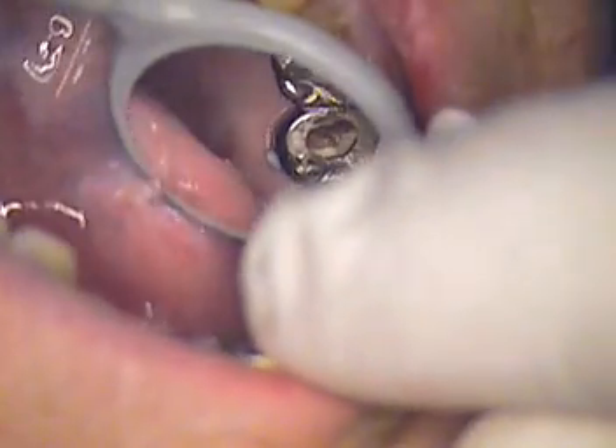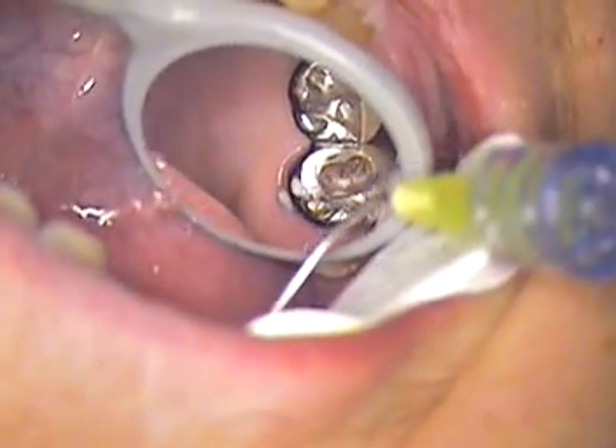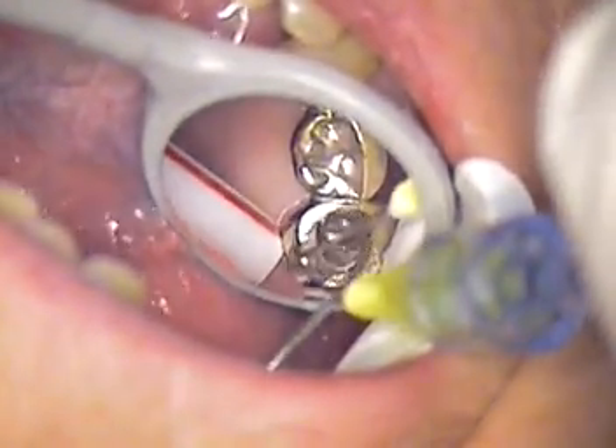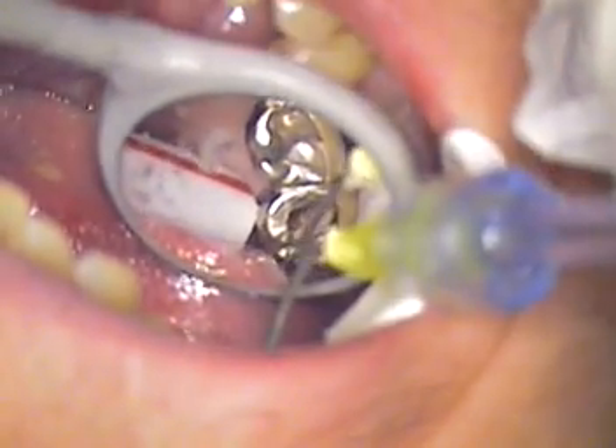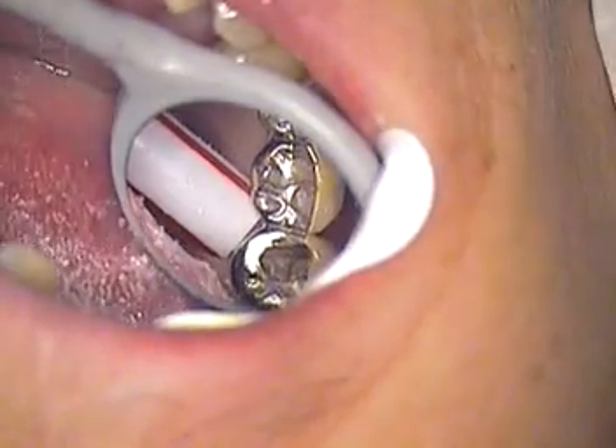We're back live — this is the second part of a three-part series. Tooth number two has a history of the posterior abutment losing its seal. She did go for a root canal. What we're doing now is we've just cleaned out the internal aspect of the tooth, making sure we got all the dentin cleaned up internally. It's not an easy thing — we did the best we could, getting all the way around as far as we could while keeping the shell of the tooth intact.